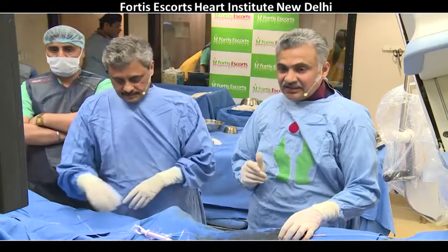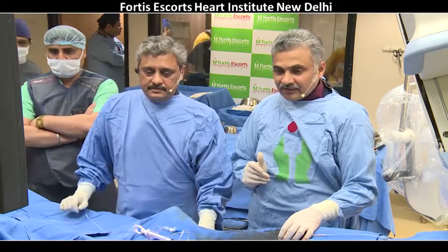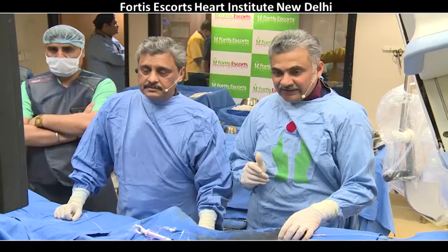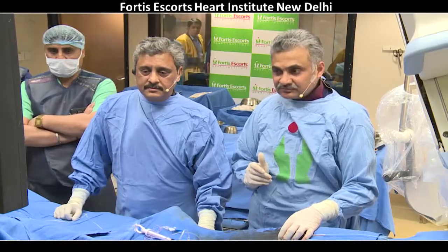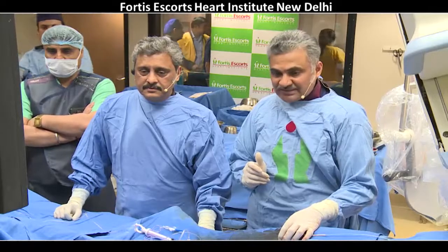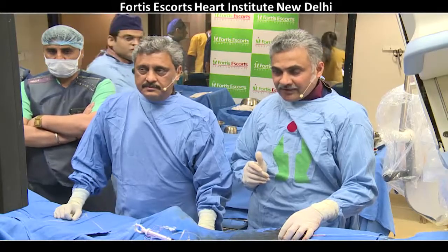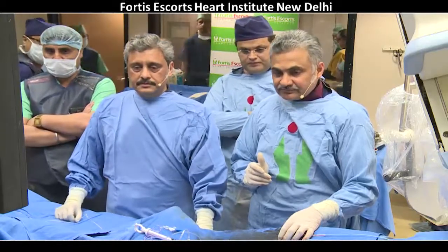The lady is an elderly lady. She's diabetic and hypertensive, and she's been having ischemic heart disease for almost a decade. The first intervention she had was in 2007. At that time, she had a stent in the circumflex artery.